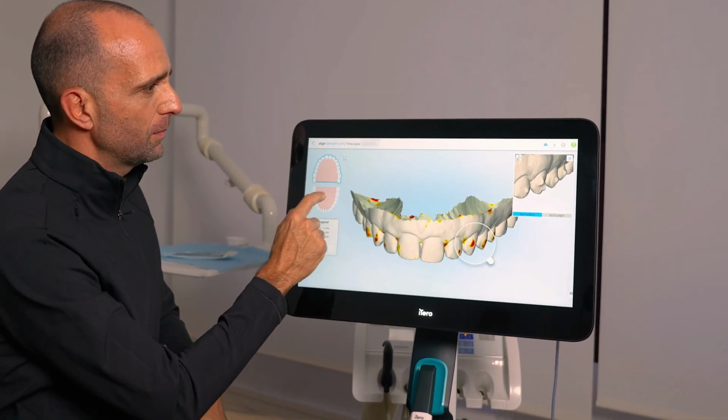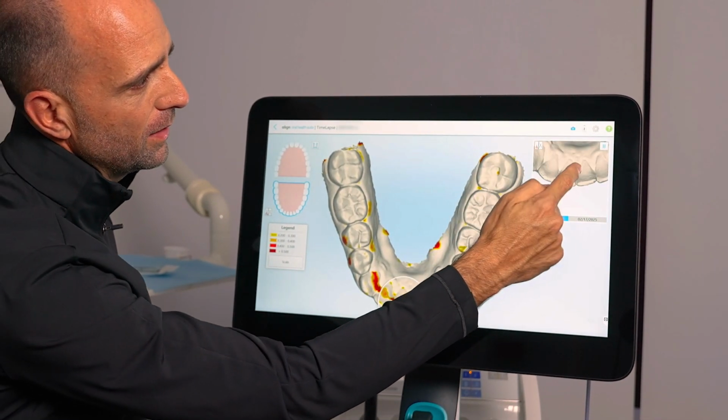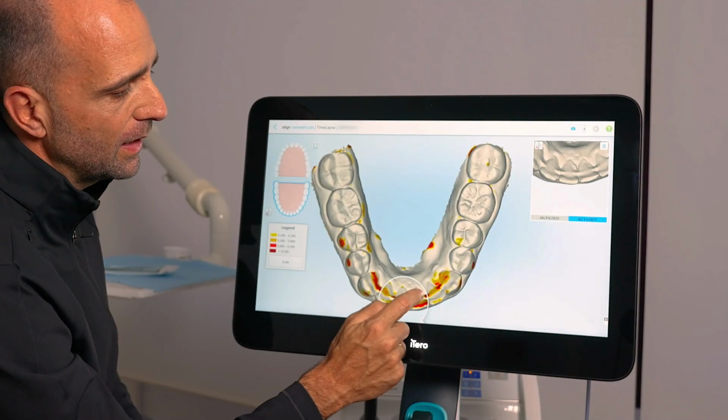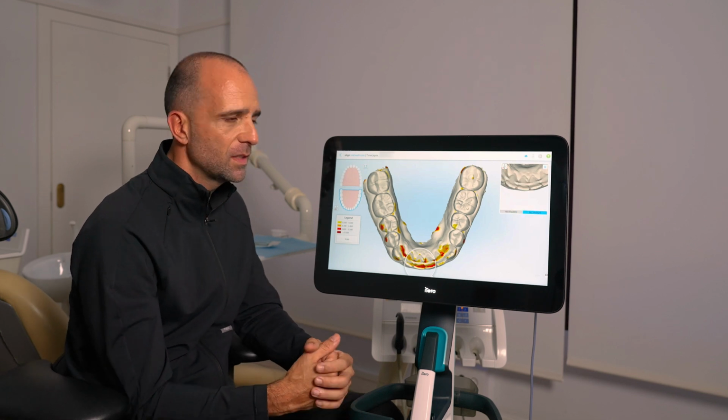And we can, for example, also in the lower part, due to wearing retention, see how she is having more plaque in this part. Here we check, the plaque is easier to see with color, but again, if we take it out, here in the model, you see how the red part is showing that she's wearing a retainer and also a little bit more plaque at this moment.